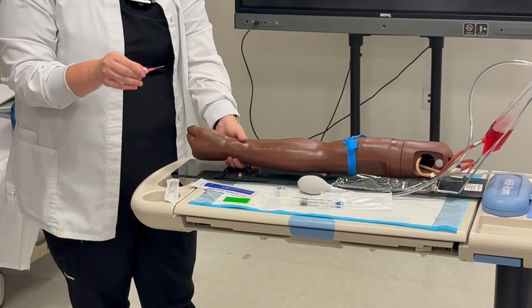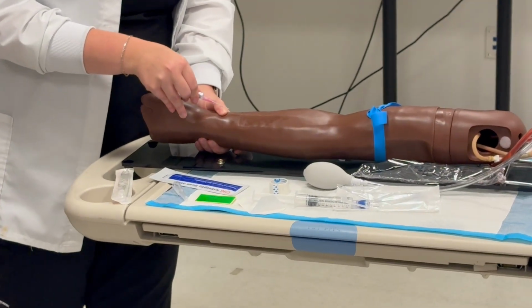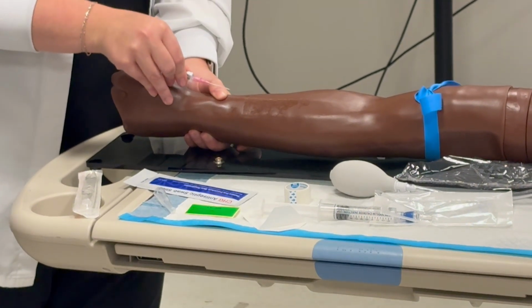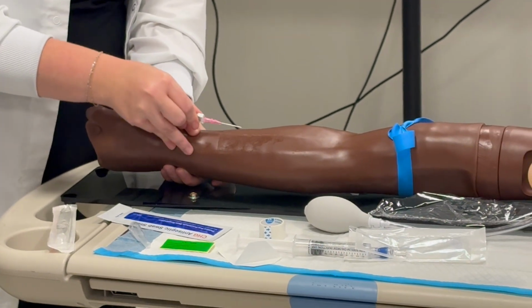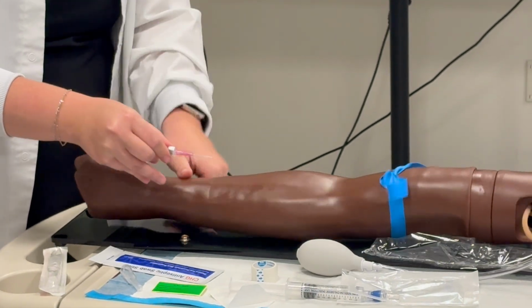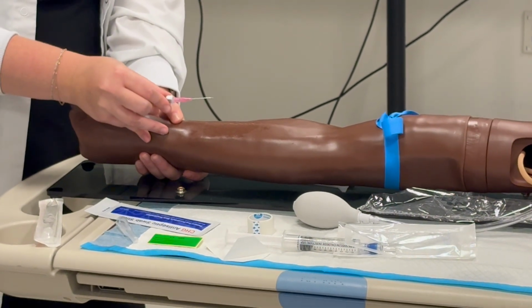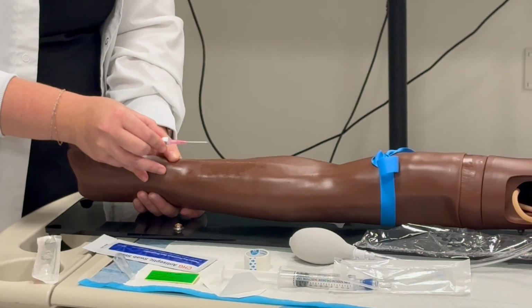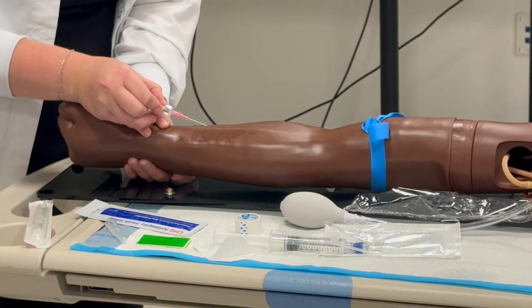Now, a real arm is going to move a lot better than this arm. It's important though that you guys don't pull taut and go like this. What am I doing? Contaminating. I'm contaminating, and I also might poke myself. So you pull taut, but you're pulling taut down here so that you can put it in up here. And this is just to stabilize the vein. Some of you guys might find it more comfortable to do it like this. I have always felt that using my thumb is more comfortable. Do you use your thumb, Mrs. S? To pull taut, yes. Okay. So we're gonna go in at a small angle, okay? We're gonna poke.